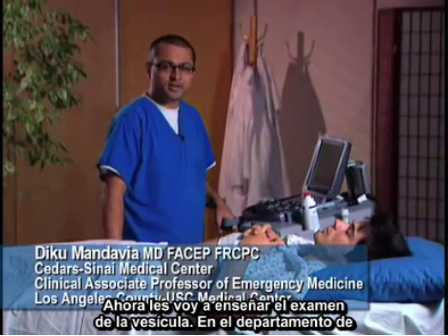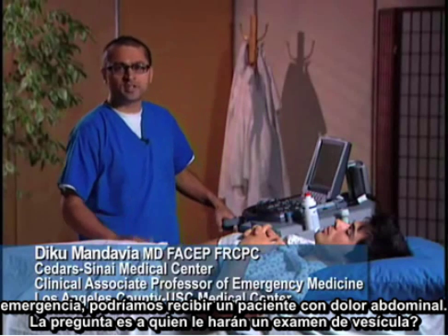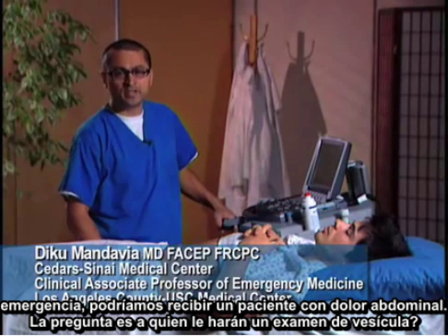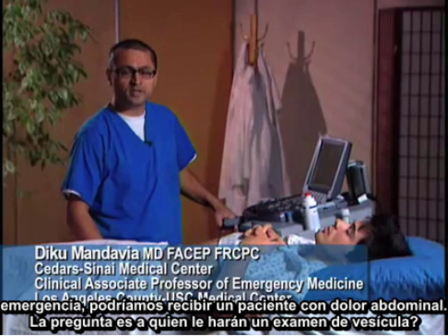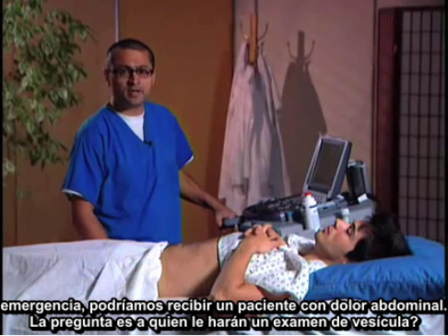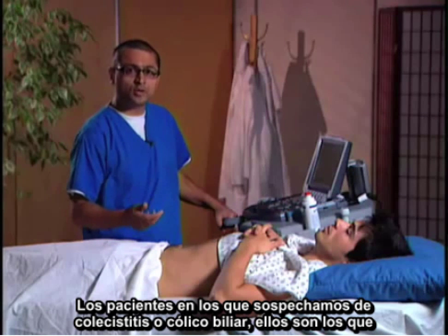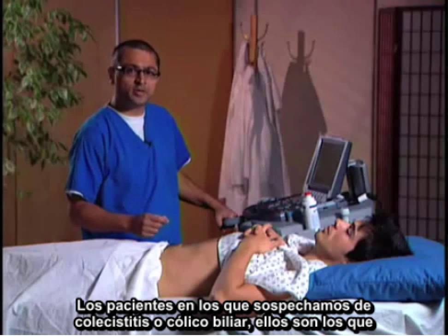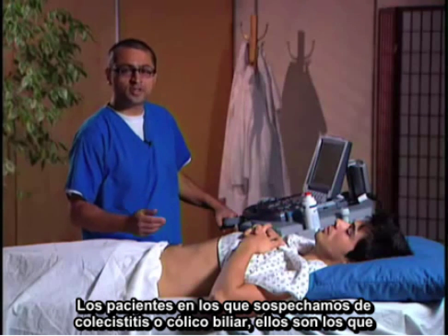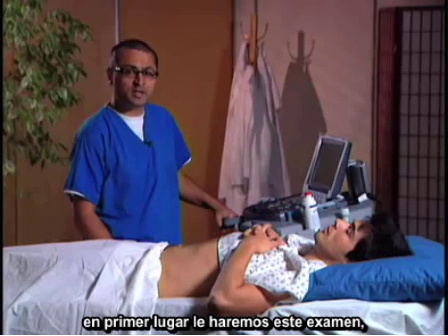I'm going to take you through the gallbladder exam. In the emergency department, you may have a patient with abdominal pain. The question is, who are you going to do a gallbladder exam on? The patients that you suspect cholecystitis or biliary colic are the ones that we're going to primarily be doing this exam on.